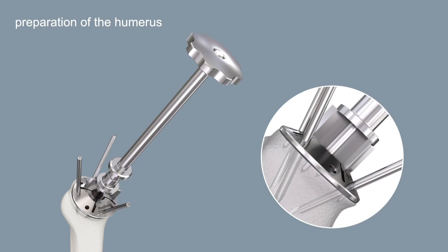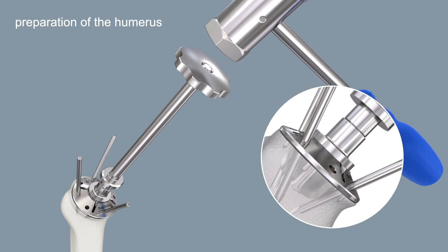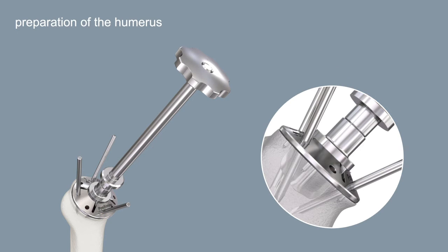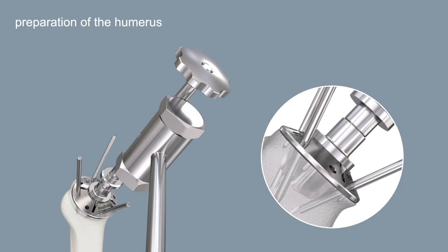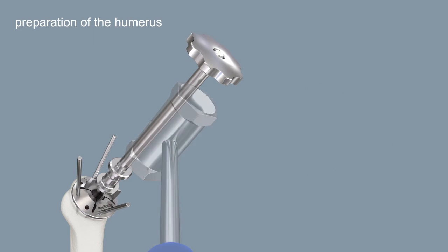Insert the pre-impactor using the positioner with gentle hammer strokes. It is mandatory to hold the positioner orthogonally to the resection plane. Insert the pre-impactor until the stopper is completely flush with the positioning disc. Pull off the pre-impactor with slight hammer strokes on the underside of the positioner handle.